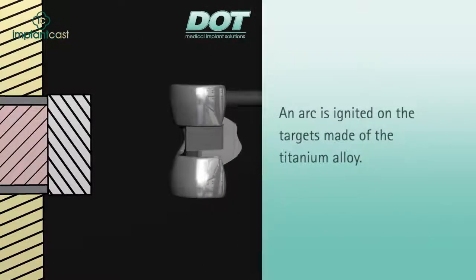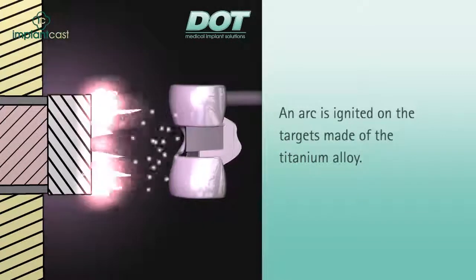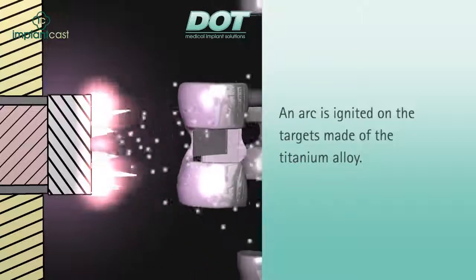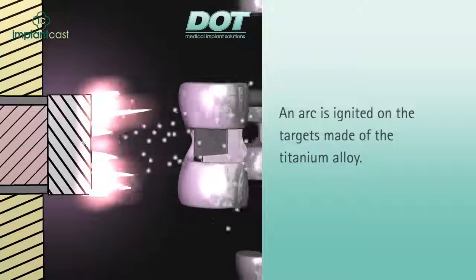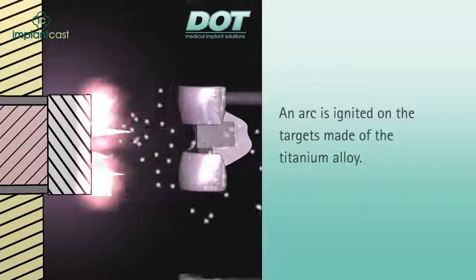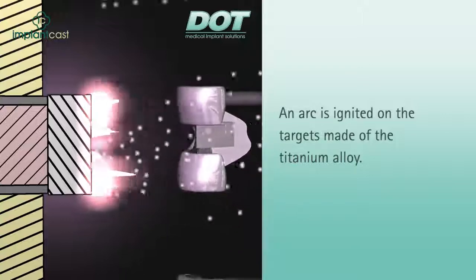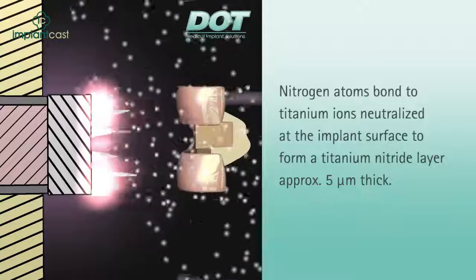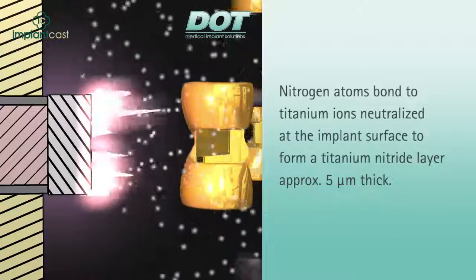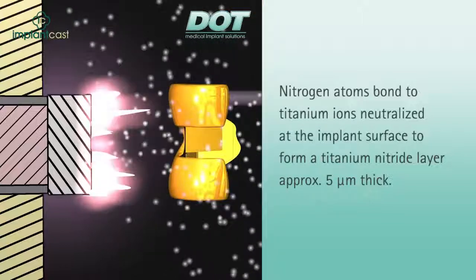The first step is to create a vacuum in the chamber. Next, the titanium atoms are liberated from the target by supplying electrical energy, are ionized, and then accelerated in the direction of the implant's surface. During this process, nitrogen is added to the vacuum chamber, and the nitrogen atoms bond to titanium ions neutralized at the implant's surface to form the desired titanium nitride layer.